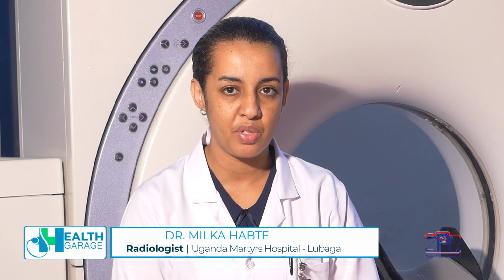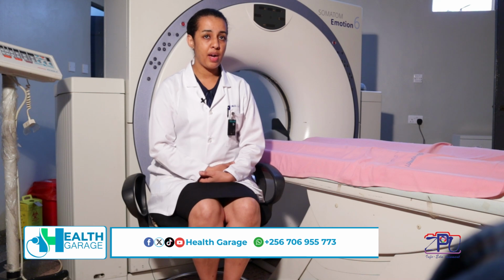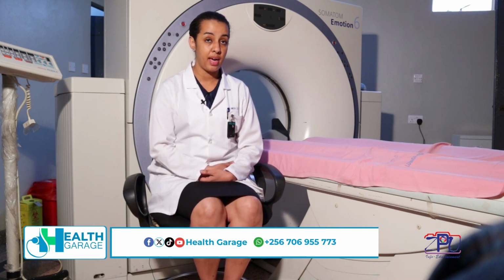So we make sure the patient knows it's not noisy, maybe some few clicks. However, it's not a noisy procedure. It's not a painful procedure. What we have to do is make sure the patient doesn't have risk factors that may end up harming him or her. So we go through a checklist and make sure the patient comes out of the CT scan procedure safe. Normally, once a patient has undergone a CT scan procedure, they go back home.